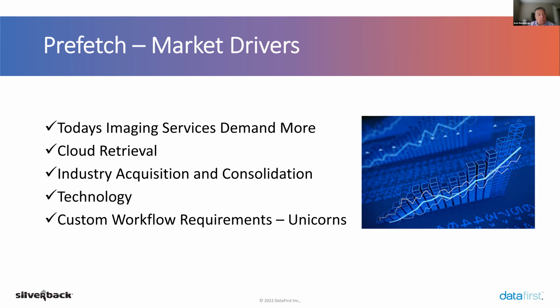And technology. We're seeing just changes in technology. I mentioned earlier, over the past 10 years, we've seen study size grow immensely, meaning having all of that stuff available, on all of your priors available on reasonably priced storage is a technology challenge.